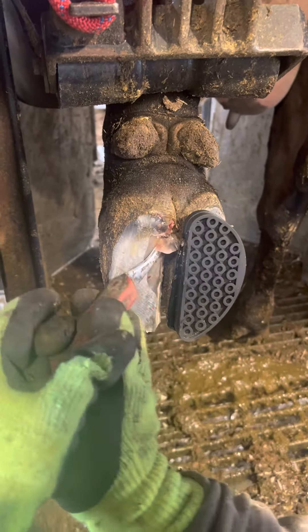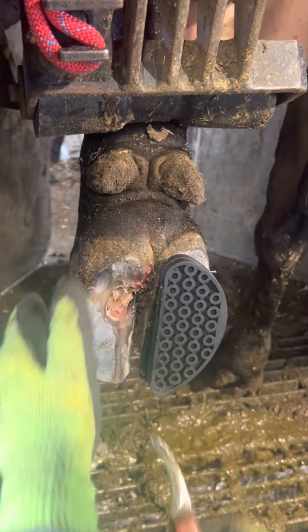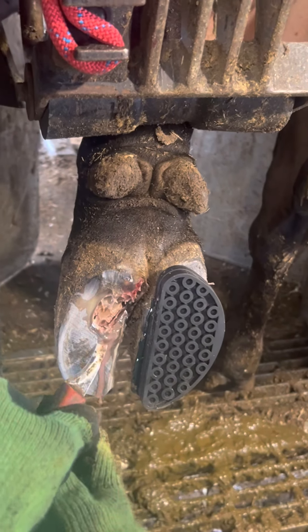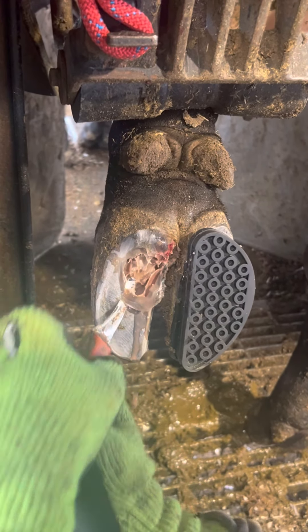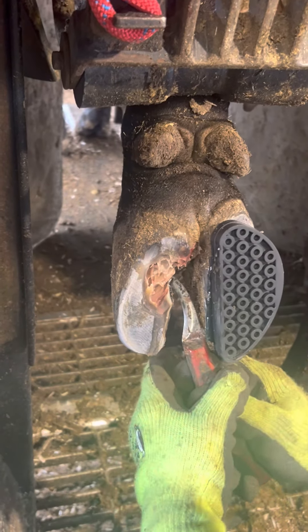As I pick away this loose horn, it seems to open up and go all the way down to the toe. It's important to remove any loose or unattached horn from the sole so that new horn can grow in and so that the lesion can dry out. This problem is usually caused from standing too long or too long of walks to the parlor, and causes the sole to bruise from the inside out.